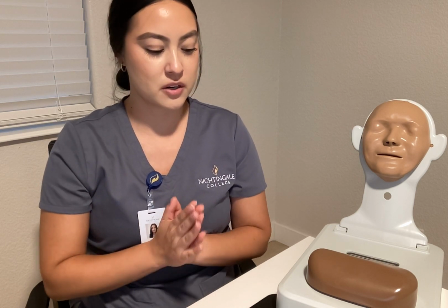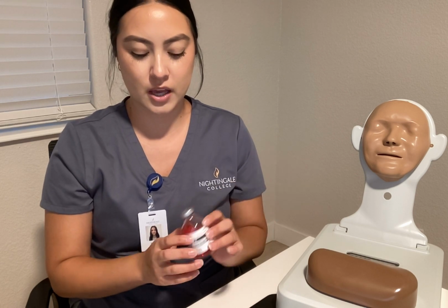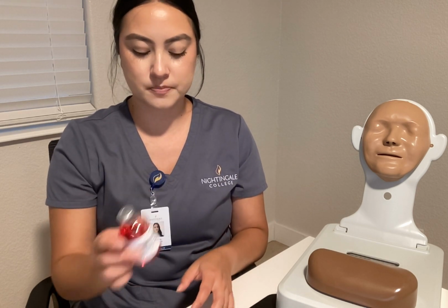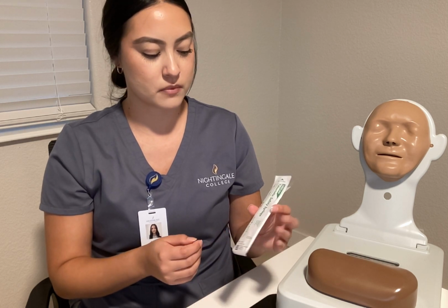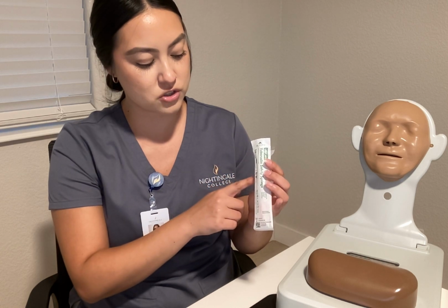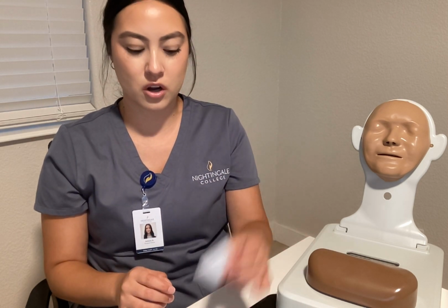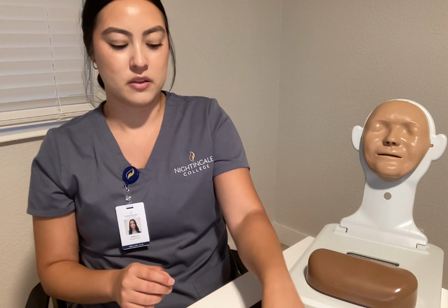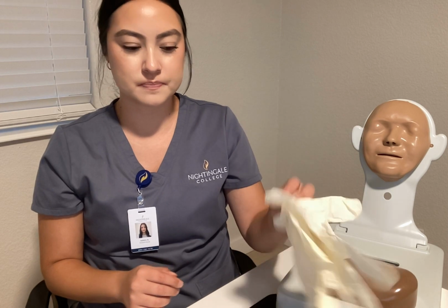Before we get started, just to go over our supplies, I have our medication, Tubersol, and then we do have the needle and syringe. This one is the 25 gauge by 5/8 in size. We have our gauze. We also have the 2 alcohol pads as well as our gloves.